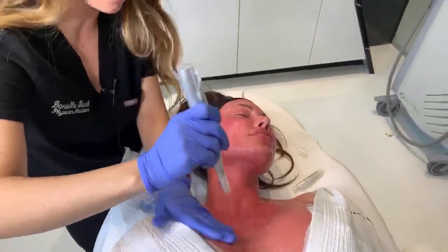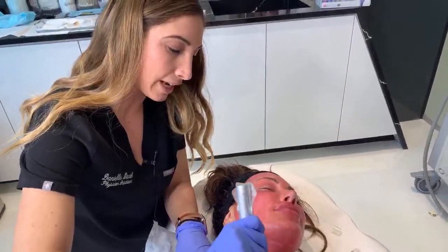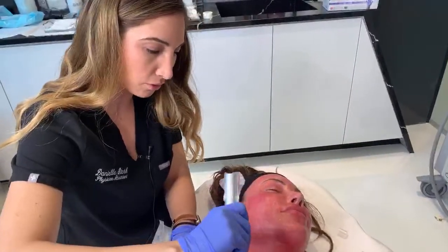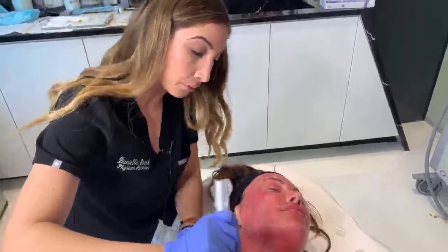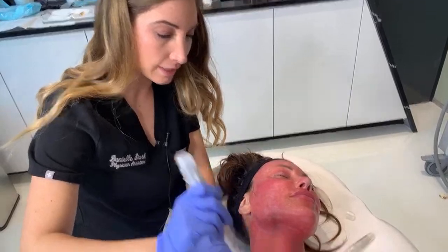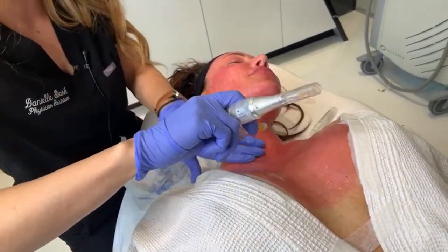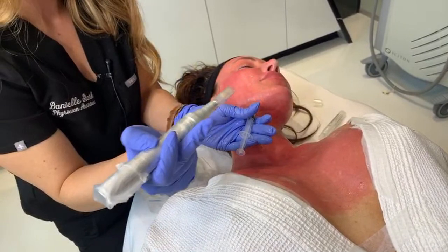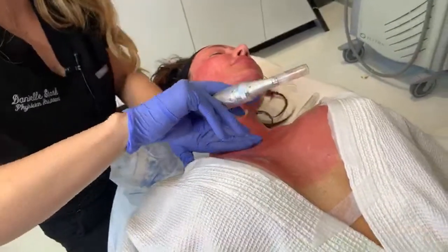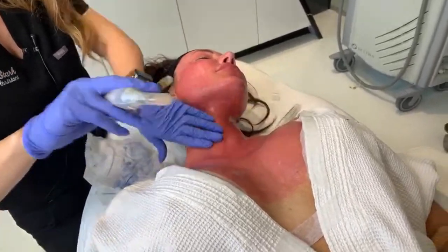So if someone comes in, you doing okay? Mm-hmm. If someone comes in and they say, well, I only have 3 days, but I want some resurfacing, you can do a light Erbium. Or if they have a week, you can go a little bit stronger. So it's really neat that you can adjust it. It's important to communicate what you want with your provider. That's how you choose what laser is best for your skin type, the downtime that you have, and what your expectations are.